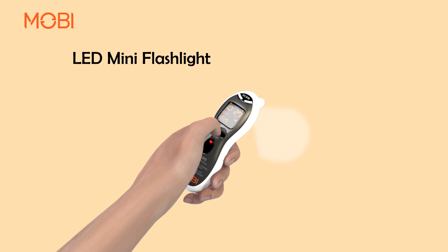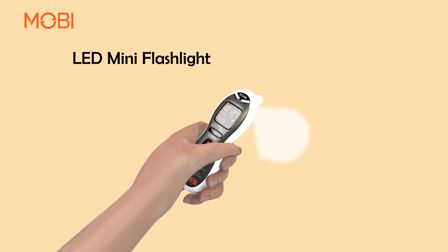Press and hold the center of the Set and Talk buttons for 2 seconds and the LED mini flashlight will turn on. It will turn off automatically after 5 seconds.